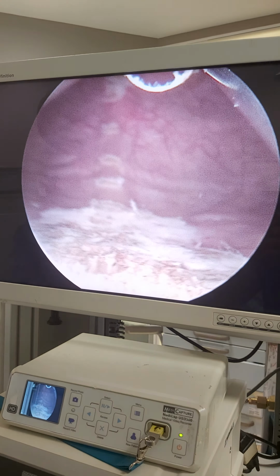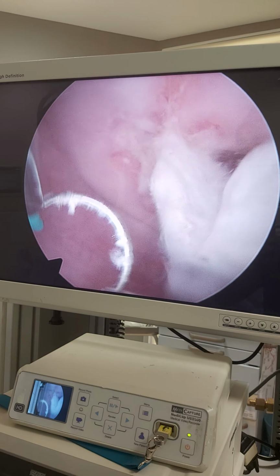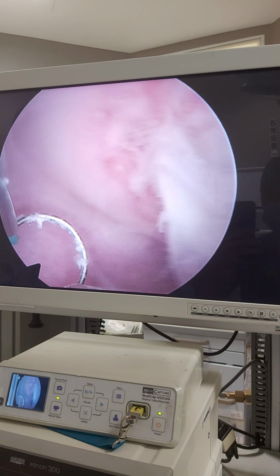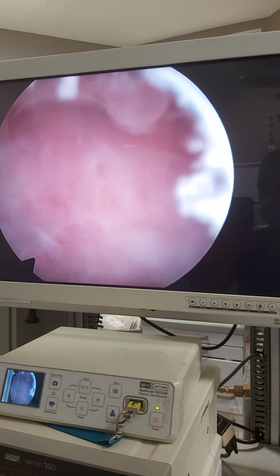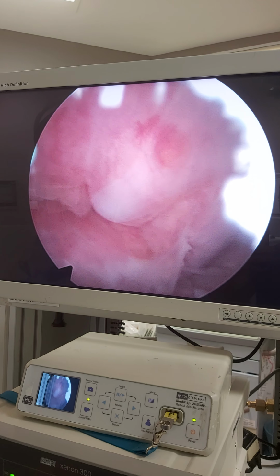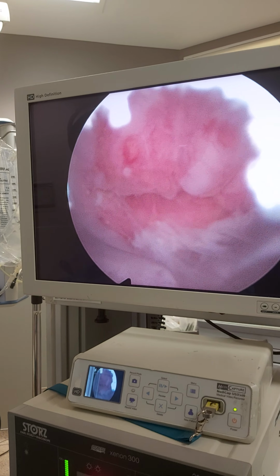Okay, it looks very nice, nicely fulgurated. I will now look at the vaginal part. This is cervix uteri. I can see there is a little too much inflammation, but okay. I'm sure gynecologists will not consider this as too much, but I see some clear tissue changes here, and I will recommend her a gynecological consultation, of course.